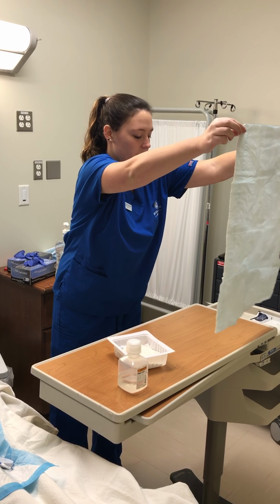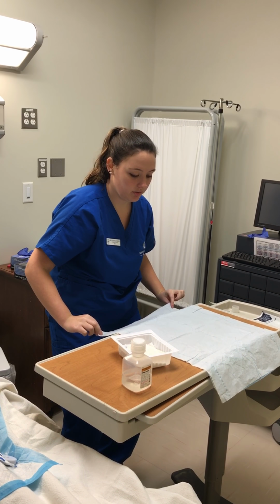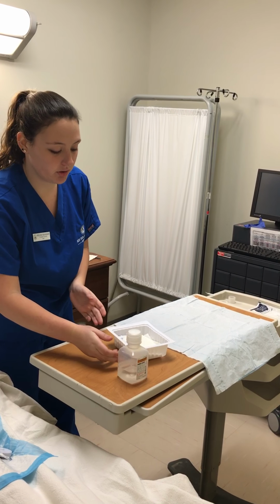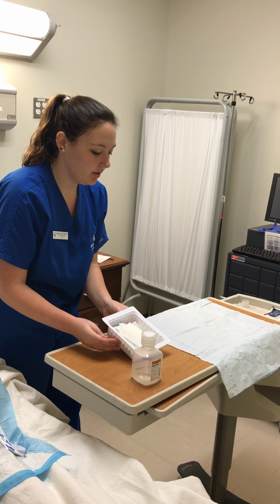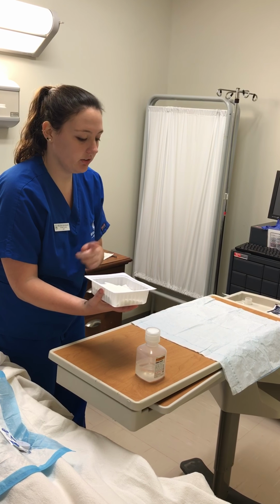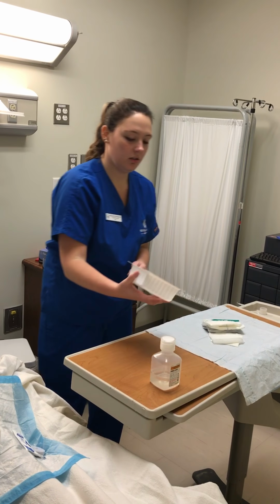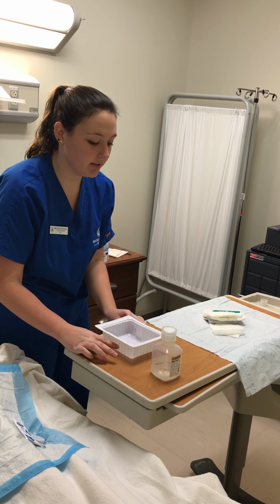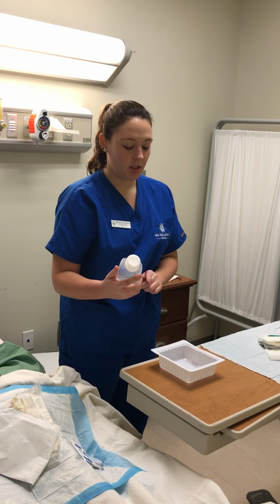Staying within the 1-inch border, I'm going to lay my sterile field down. I'm going to then carefully, not touching the surface of my tin, dump the contents in the middle. Okay. Next, I'm going to pour some saline into my tray.